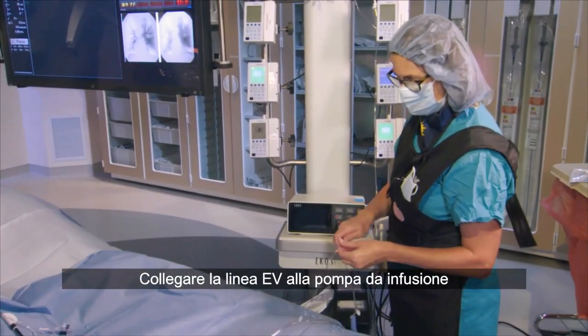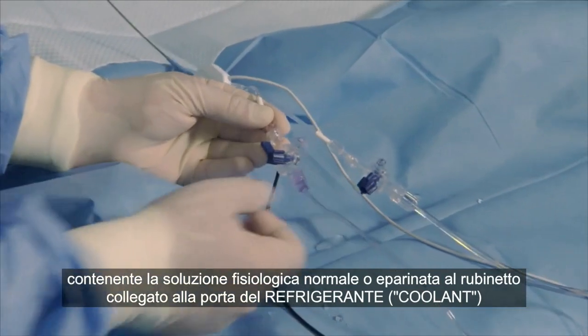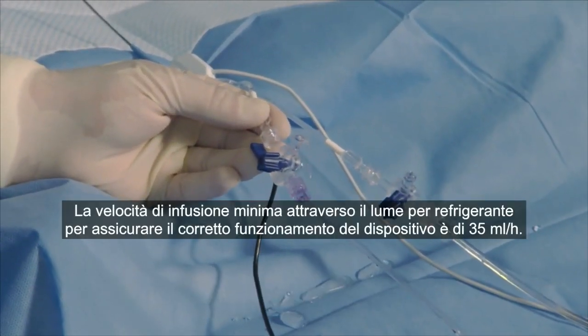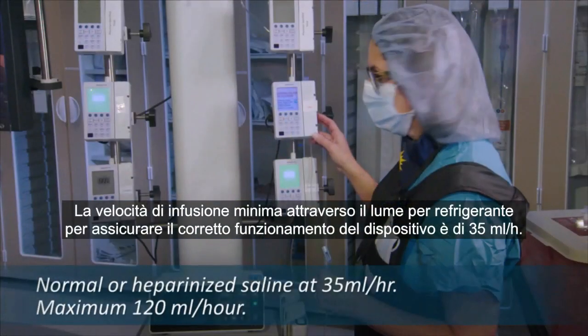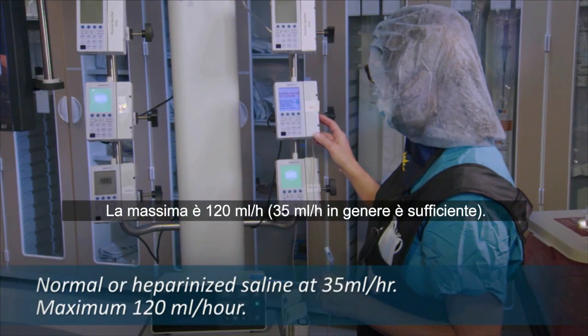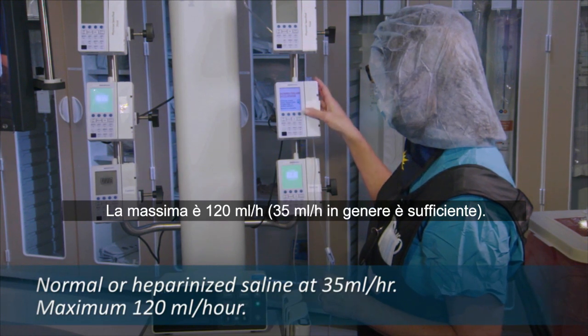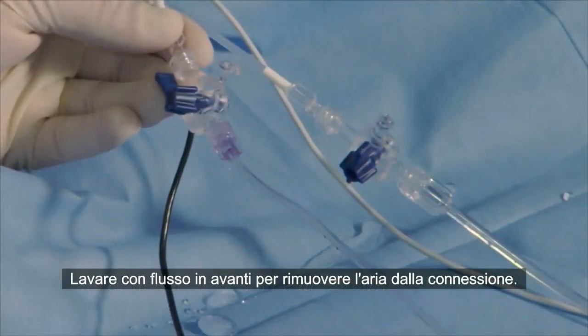Connect the IV line on the infusion pump containing the normal or heparinized saline to the stopcock attached to the port marked coolant. The minimum infusion rate through the coolant lumen to ensure proper device functioning is 35 milliliters per hour. The maximum is 120 milliliters per hour. 35 milliliters per hour is usually sufficient.